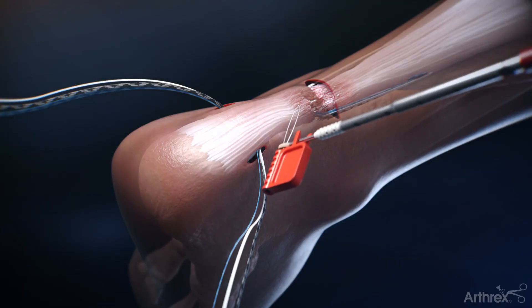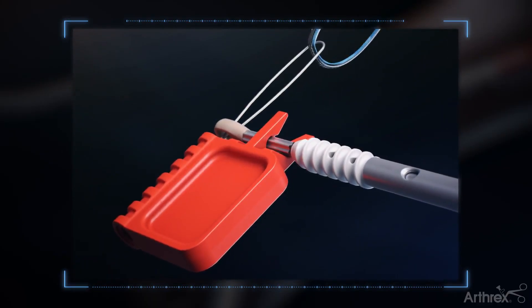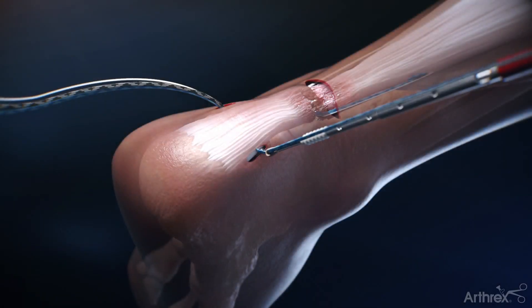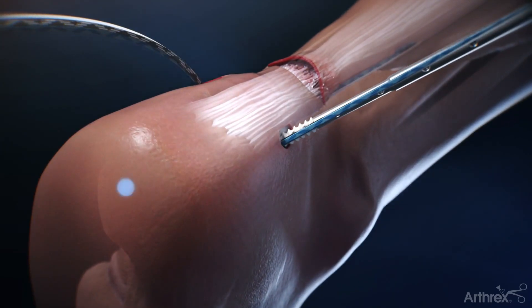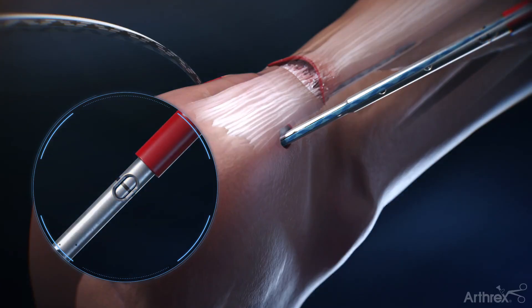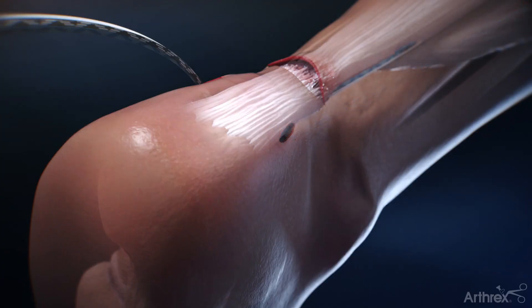The suture tapes are then loaded through the eyelet of the DX 3.9 biocomposite swivel lock anchors. The foot is plantar flexed 10 to 15 degrees to approximate the tendon ends. The swivel lock anchor is placed into the prepared hole to secure the suture tapes. The laser line feature on the swivel lock shaft can be utilized to confirm when the anchor is flush or 2 millimeters countersunk.